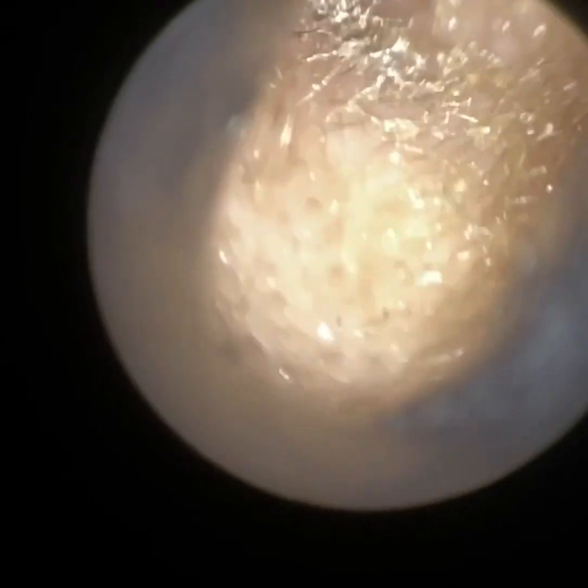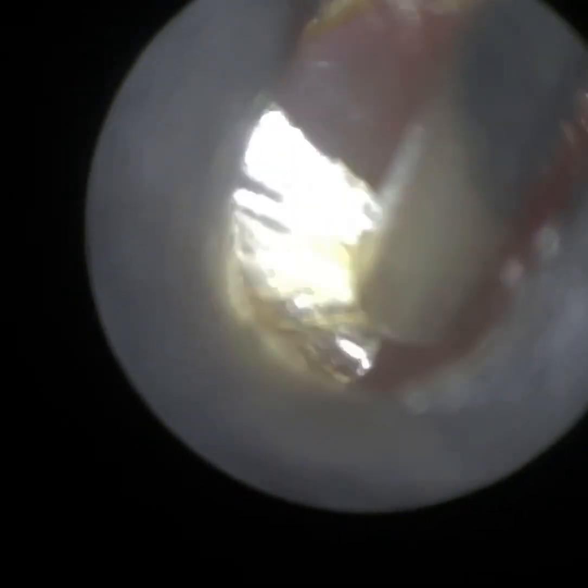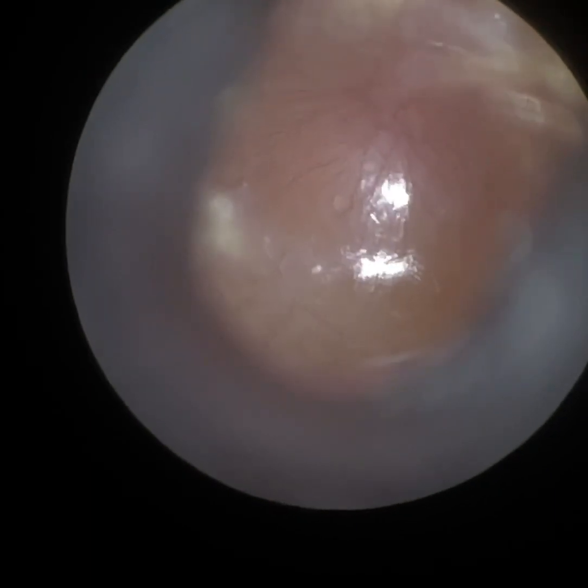What I'm finding with the Waxscope is it's really suitable and great with children and also patients who are less cooperative or less steady, and that's because the tip of the speculum — the proximal end of the tip of the speculum — it's flared. Just like your shea or rosin specula, and that prevents not only over-insertion but that flared proximal end gives you some more stability, which is great with children.